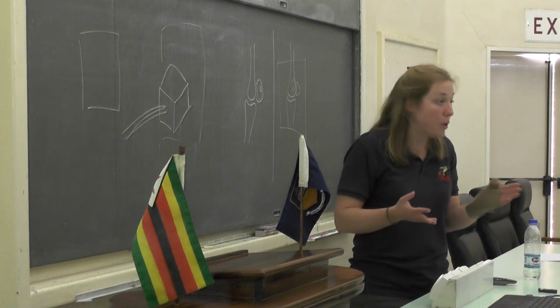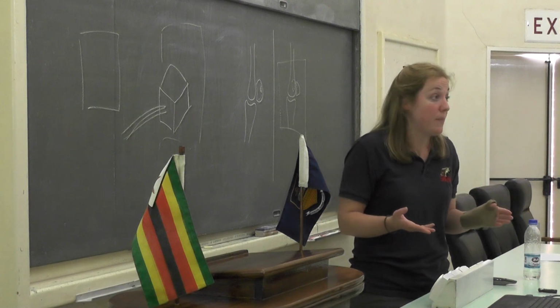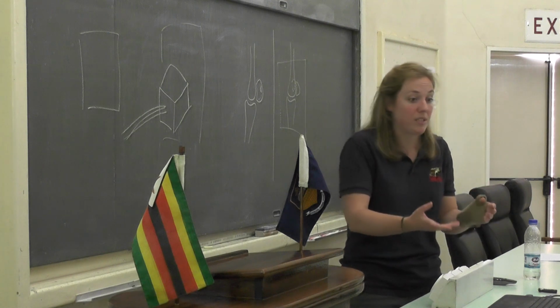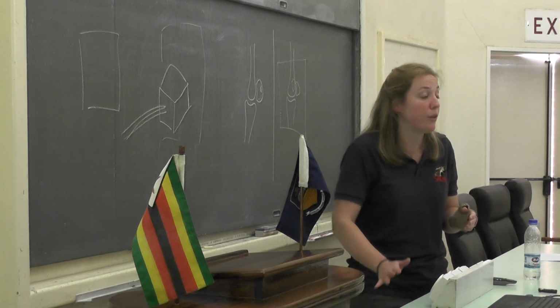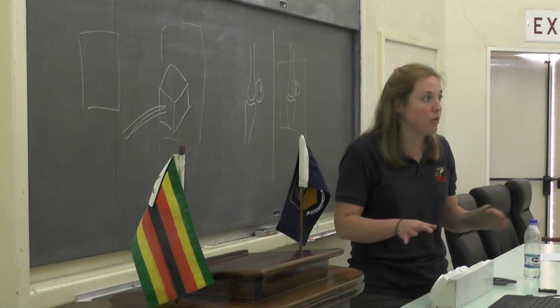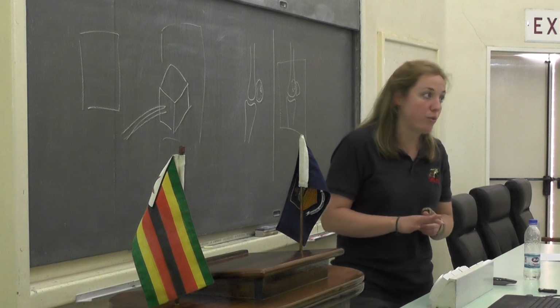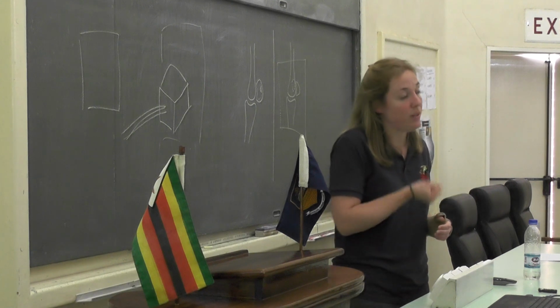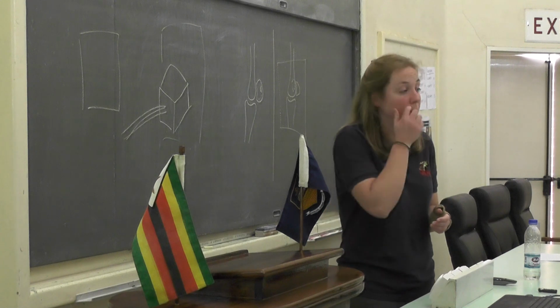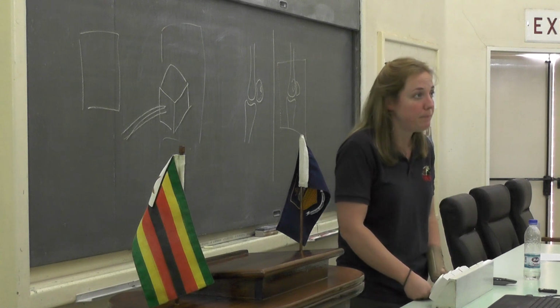It's not to say that it's impossible, and sometimes we have to x-ray animals that are not weight-bearing, either because they're too painful or there are other reasons we can't put that limb on the floor, and we just need to make do. But in an ideal scenario, you would have them weight-bearing for the routine views, unless you're specifically looking for the flexed views and the ones that highlight other parts of the anatomy.